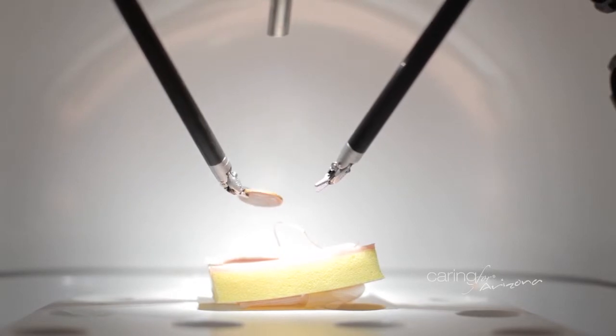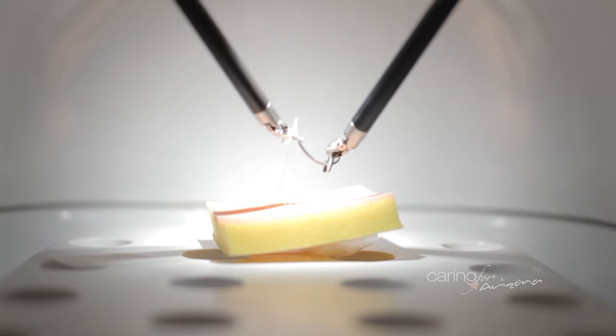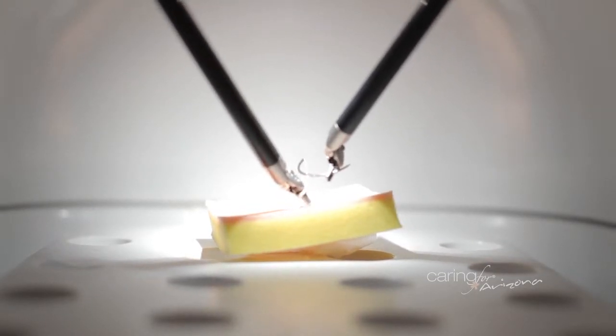A good example of a surgery that can be done a number of different ways would be a ventral hernia. Like let's say you've had a surgery on your abdomen and now you have a bulge and a hernia. That can be fixed in a traditional open surgery where you make an incision right over the abdomen, go in, fix the hernia. Laparoscopically, where you do it with small incisions and from the inside, or even robotically. The advantage to the robot in that situation is I like to close the hole, meaning the hole in the muscle needs to be closed in order to get a good repair. It's a little difficult to do laparoscopically, but with the robot, it's really easy to close that and then put mesh on top of that. That's going to be the most durable repair and offer the best long-term results with a shortened recovery time when compared to a big open surgery.